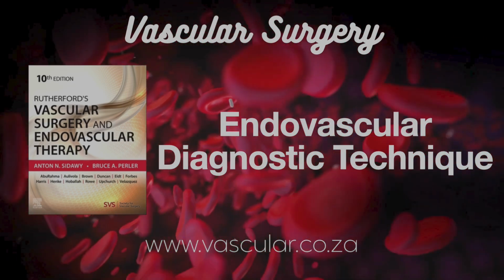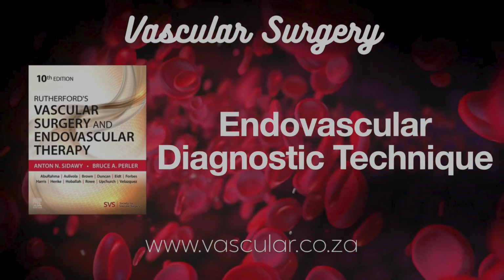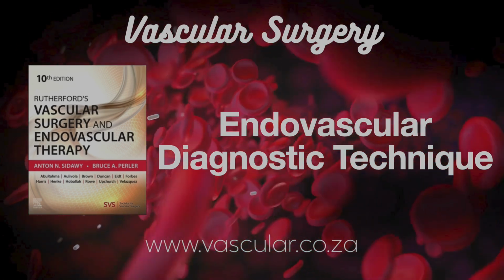And if you need to repeat it, that's a lot more contrast and radiation. So what's method 2 if you need better detail? Selective catheterization. This involves guiding a catheter up and over the aortic bifurcation into the specific leg you want to image. How do you get up and over?